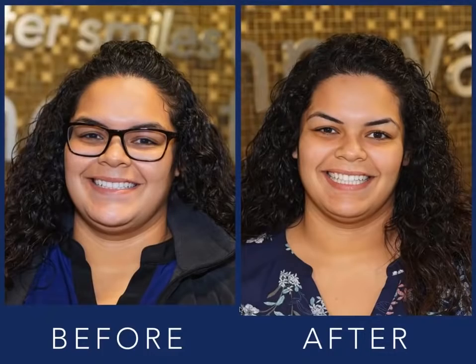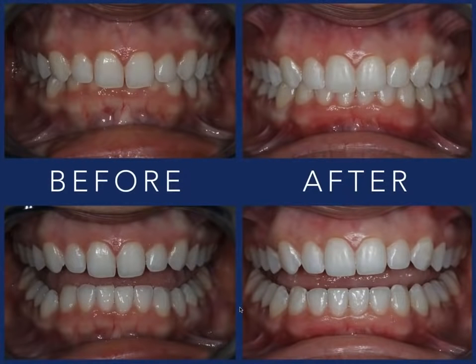Would you like me to tell you about that? And you'll be amazed. Patients will go, yeah, talk to me about that. What is that? Why is that so worn? I'm 27 years old. I don't get that. And so that's what we get to discuss when we take proper photos and show them the condition they have. But with this lady right here, you can see that lower curve of Spee, how we were able to level that off and get a much better bite relationship. That was done in 4 months. That was just Propel, by the way, with her, and we used 5-day tray changes there to achieve that.